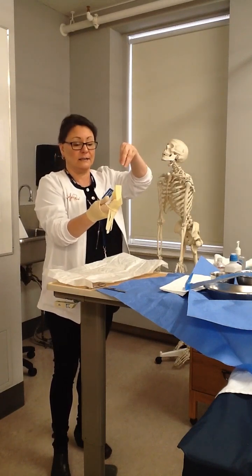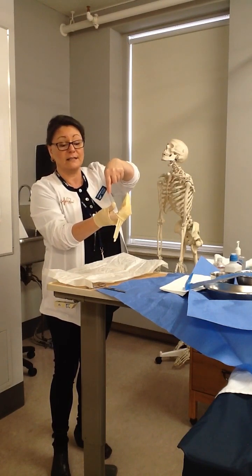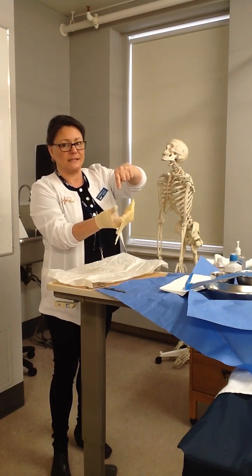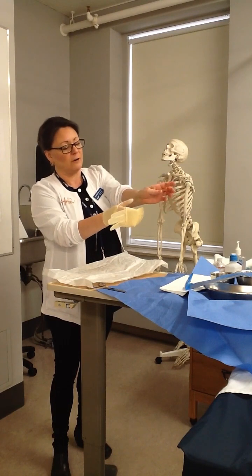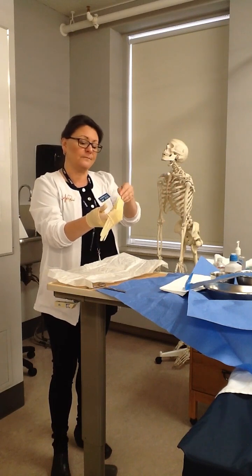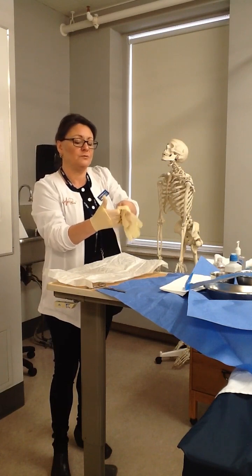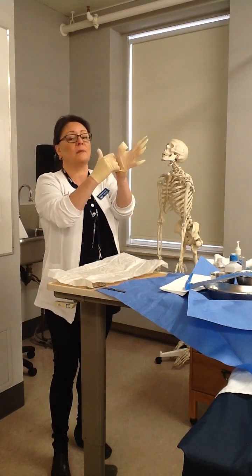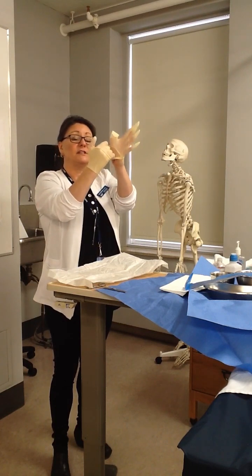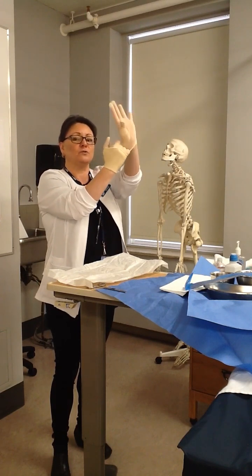I'm going to tuck my left hand in, but this time I'm going to be really careful to make sure my right sterile thumb, right here that's already gloved, is abducted away, because I don't want it to run down my wrist and contaminate my glove when I'm putting on my left glove. So I'm going to reach my hand in, abduct my thumb, and turn my hand up towards the ceiling as I find the home for all my thumb and all my fingers. My dominant hand right here is just stationary and pulling down. My left hand is making a wave towards the ceiling.